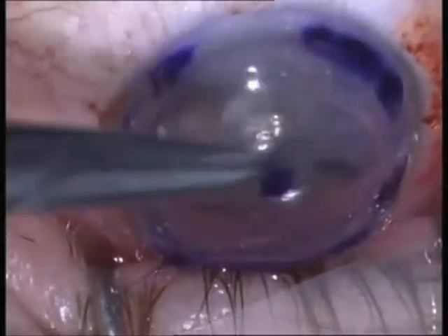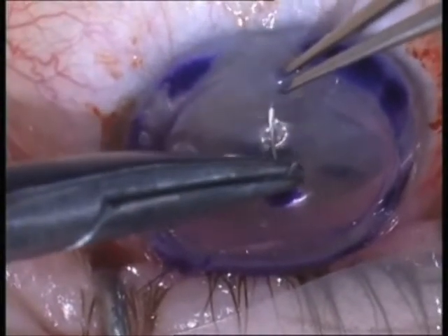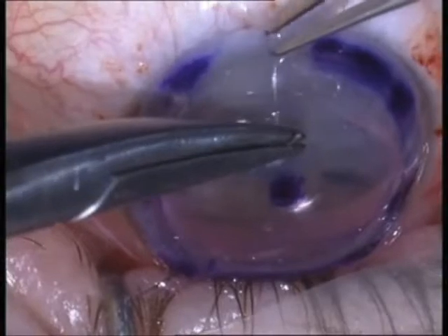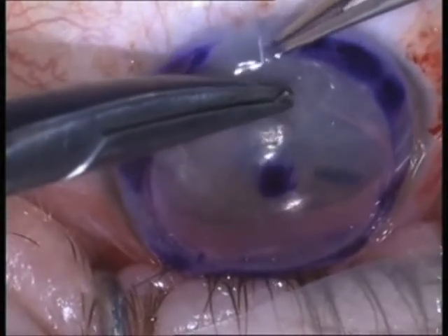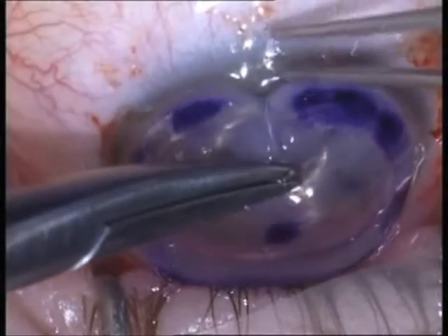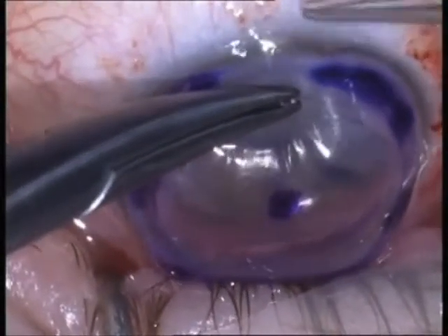After removal of the Descemet's membrane, the flange of the donor tissue is tucked into the peripheral intrastromal pocket of the host created previously, and 16 to 20 interrupted sutures with 10-0 nylon are applied to secure the graft onto the host bed.